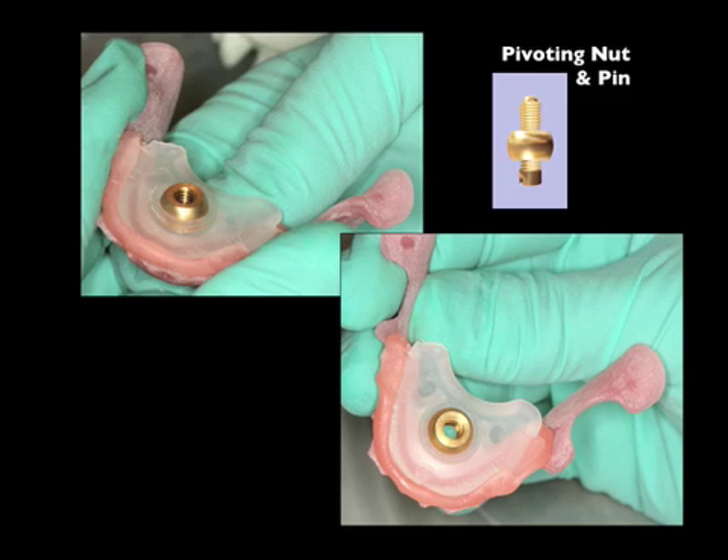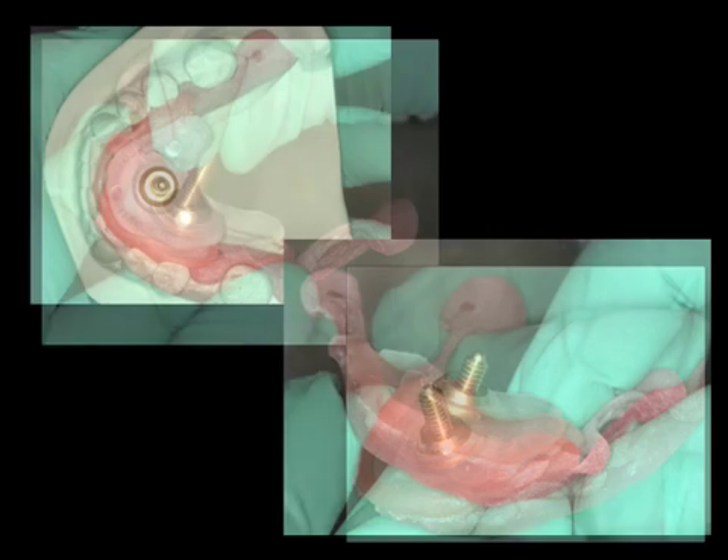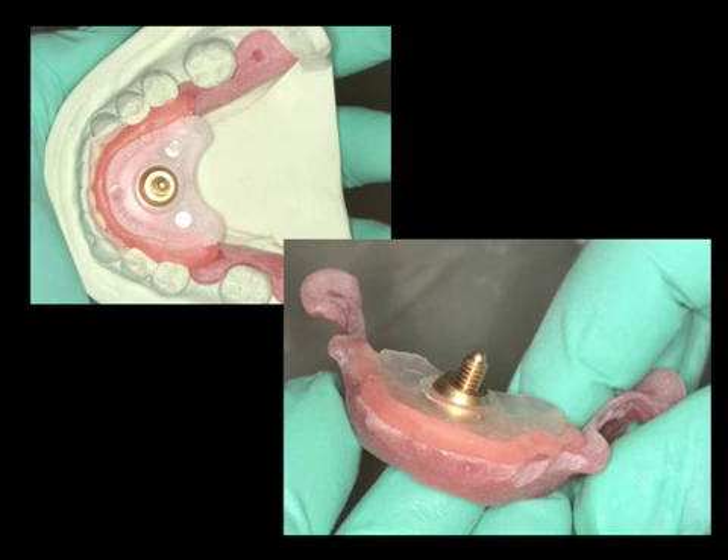This shows the nut completely seated into the pin receiver. We are now placing the pin into the nut. Once placed, we can upright the pin to a vertical position. The pin can be rotated laterally or anterior-posteriorly — this was specifically designed because not all jaws will be parallel with the recording devices. Therefore, the practitioner can easily rotate the pin until it strikes perpendicular with the plate.